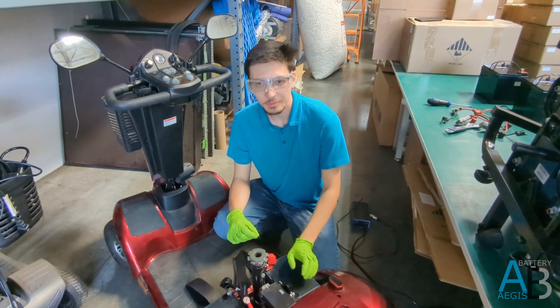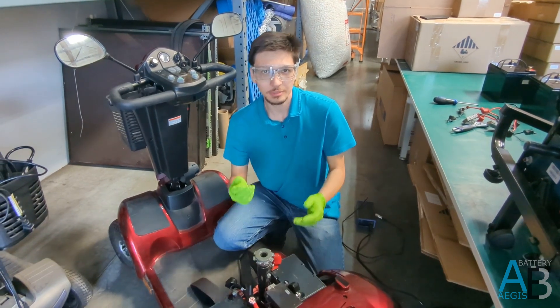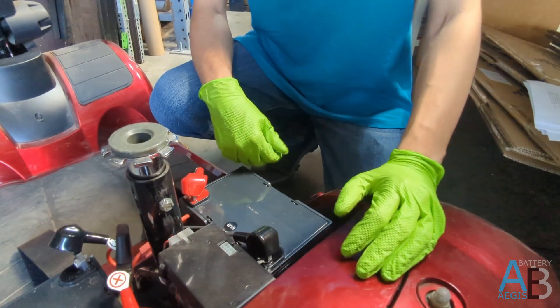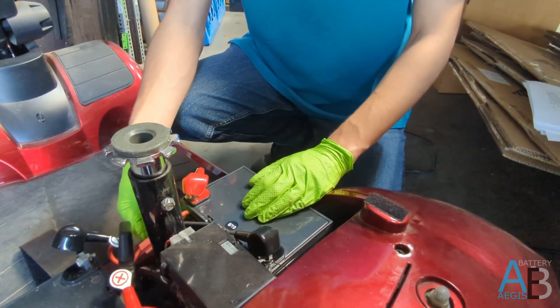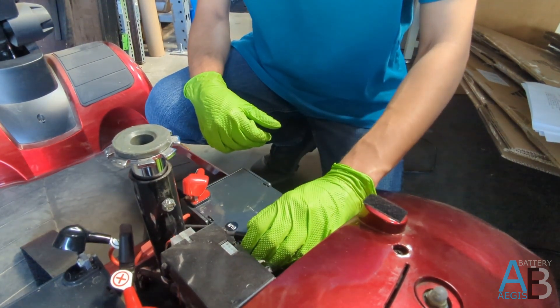Handling batteries — exposed wires or terminals might result in a shock or spark. So always wear safety gloves during the process. Before getting started on the removal process, you want to ensure that the original cabling matches the terminals of the original battery: red-to-red for positive, and black-to-black for negative.